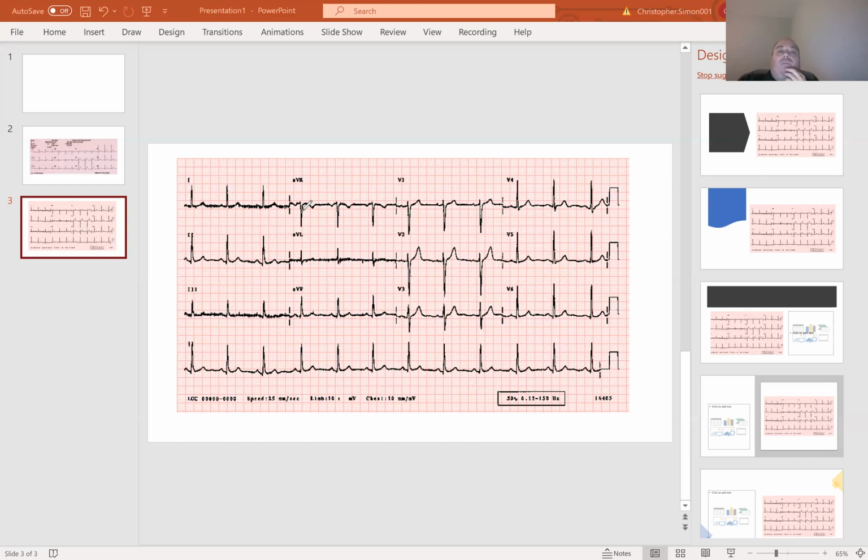So for right now, guys, the purpose of this video was just to explain what the leads were and what they're looking at. I would definitely know those coronary arteries. You're going to need to learn those because when we get into the next module, it's going to play a big role. And for those of you who are interested in the yearly challenge bowl and things like that, at the FAPA convention a couple of months ago at Marco Island, there was literally a question asked in the competition like, what leads are associated with the right coronary artery, or something along those lines. Or maybe it was 2, 3, AVF, what coronary artery was it? Maybe it was that way.